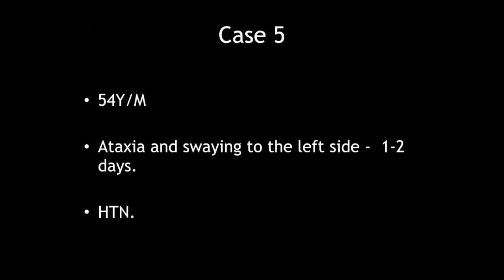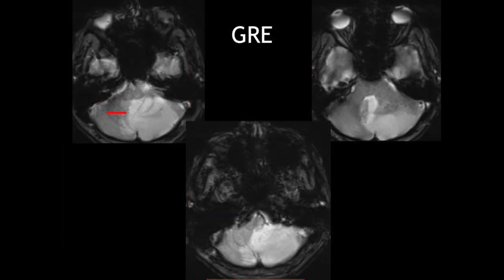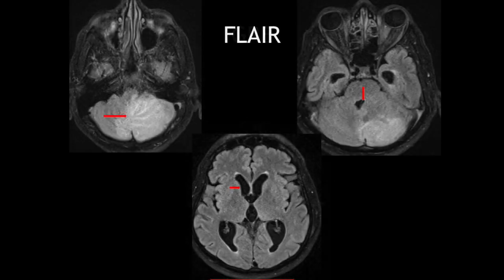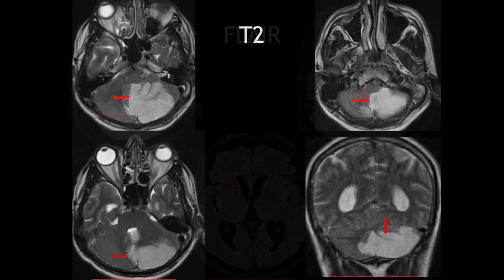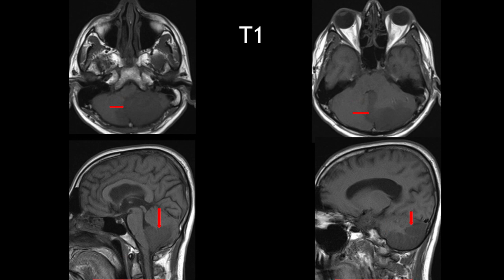A 54-year-old male with known hypertension had ataxia and swaying to the left side since one or two days. MRI showed a large wedge-shaped area of restricted diffusion within the posterior fossa involving the left cerebellar hemisphere, with no blooming to suggest hemorrhage. It was causing mass effect with effacement of the fourth ventricle and resultant dilatation of the third and bilateral lateral ventricles. T2 coronal and T1 sagittal images showed classical involvement of the inferior cerebellum, consistent with a non-hemorrhagic PICA territory infarct.